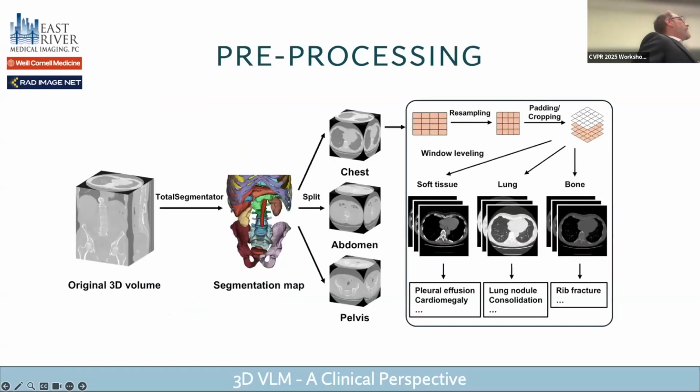All right, so I'm going to spend very little time on this because you wouldn't want an MD telling you about these models, but I'll just put it up because this is something that Vish and Shan and I are working on, like the other people. And I'll just put it up to make a point of these things that I do that are being used in the model. So this is our pre-processing, obviously using the segmentation, picking out the different CT windows to look at things the way I would look at them.